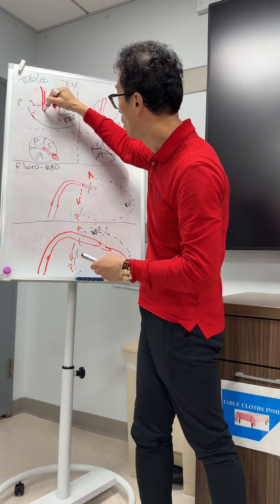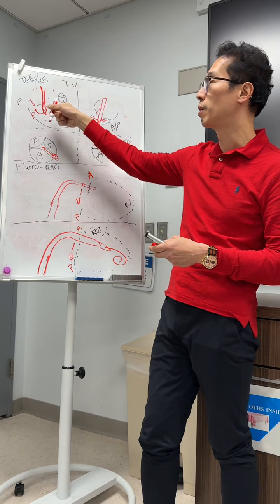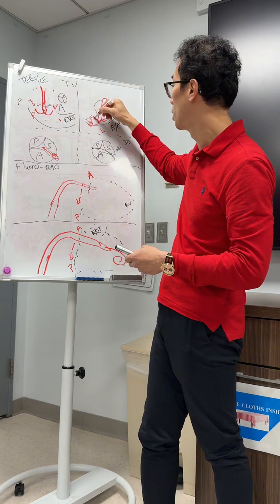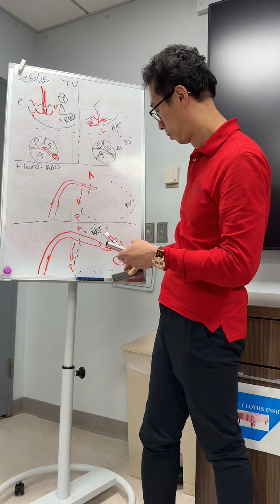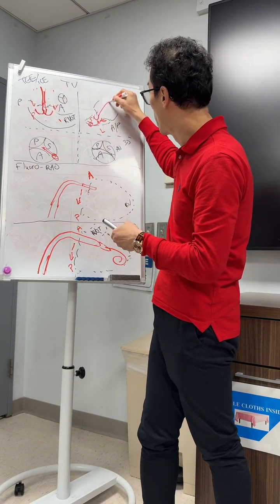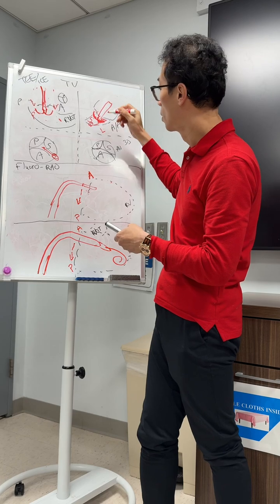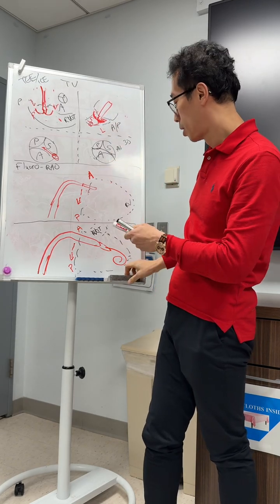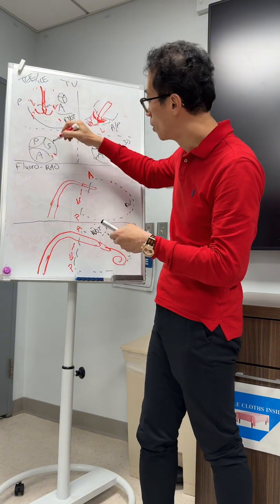So here, now you have your anchor exposed, like this, in this orientation, and let's optimize the orientation here. Right, you want to be coaxial. Okay, and now, this view is very important.